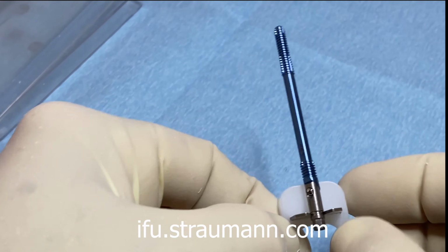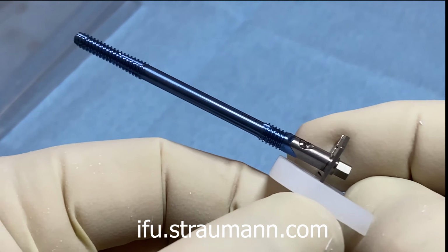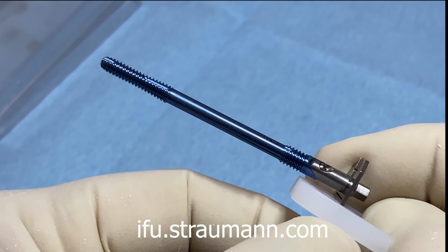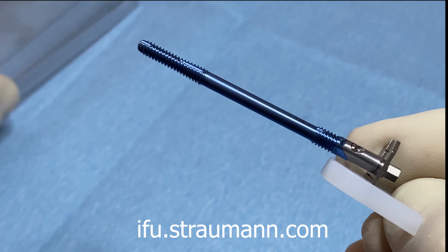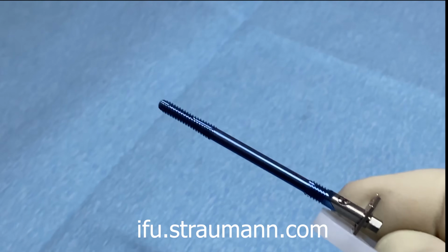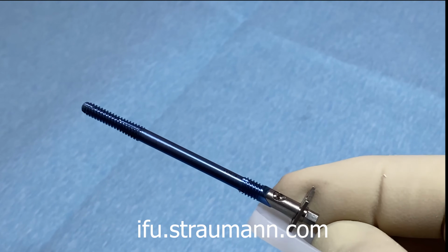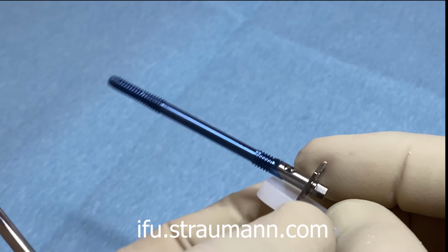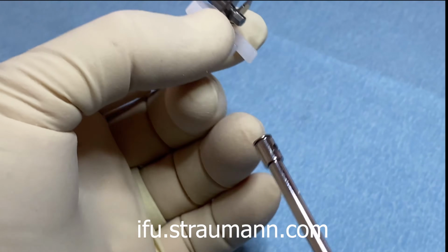Now the implant is on a fixture mount, so the fixture mount is already on the 55-degree head, and so the implant can be nicely rotated into its position. What I like to use is what is traditionally called the onion driver.